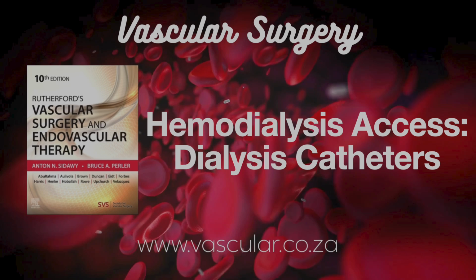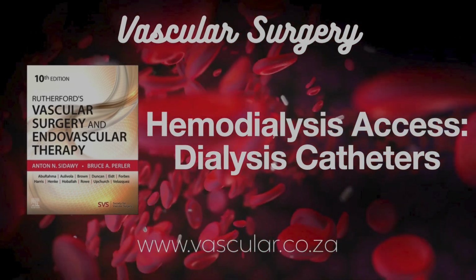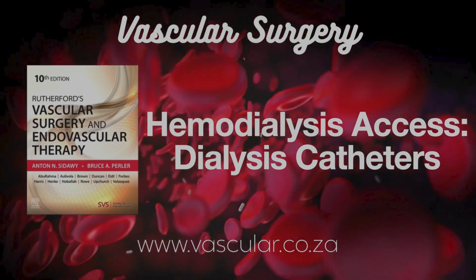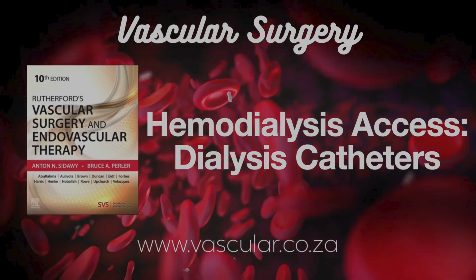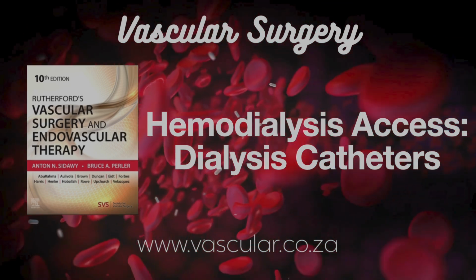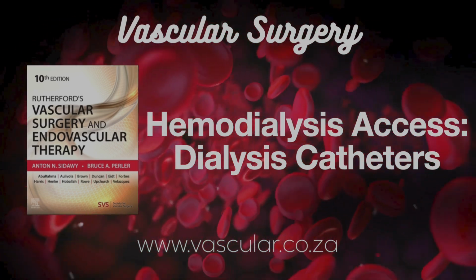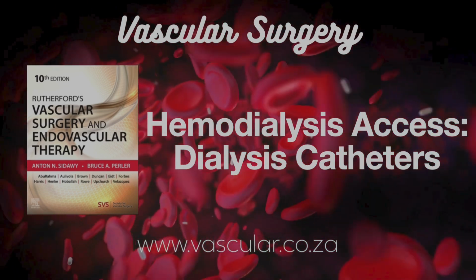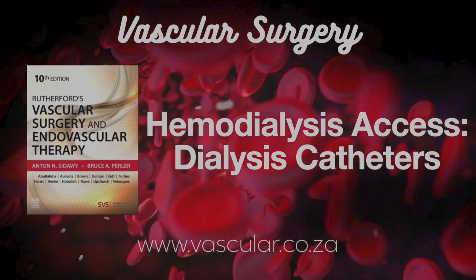And you're watching all this on the X-ray screen? Constantly watching the wire's movement under fluoroscopy, making sure it goes down towards the heart smoothly. Okay, wire's in place. How does the fairly bulky TDC get in? Well, sometimes you need a bit of firm, steady pressure, especially if there's scar tissue. The key is ensuring that guide wire travels down the superior vena cava, ideally into the inferior vena cava, without going into the heart chambers themselves.